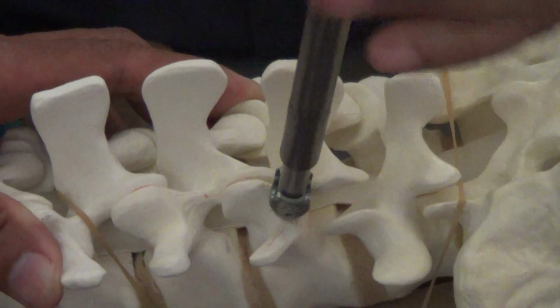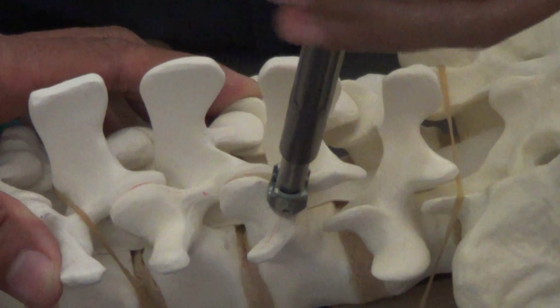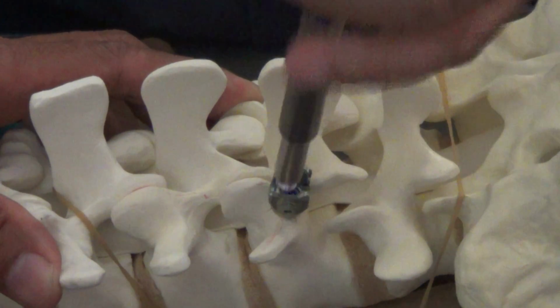Once, can you have a screw, please? Then the next question is, how deep should you go? Right?